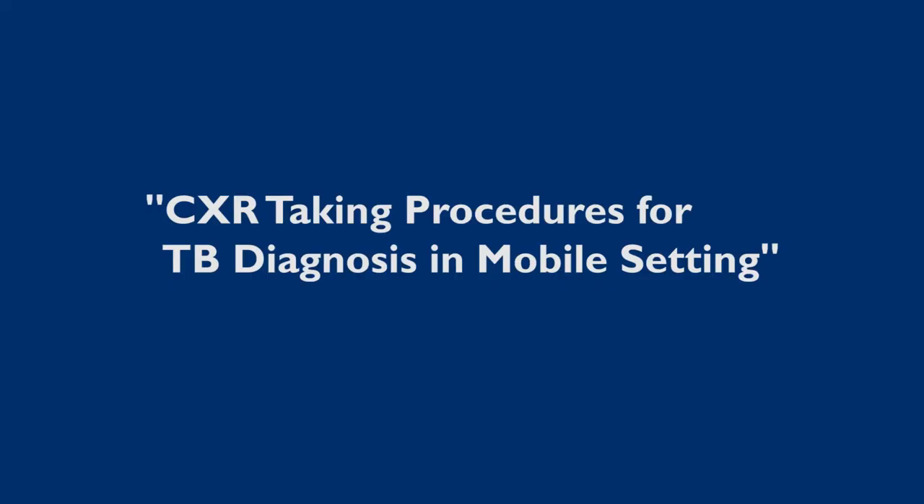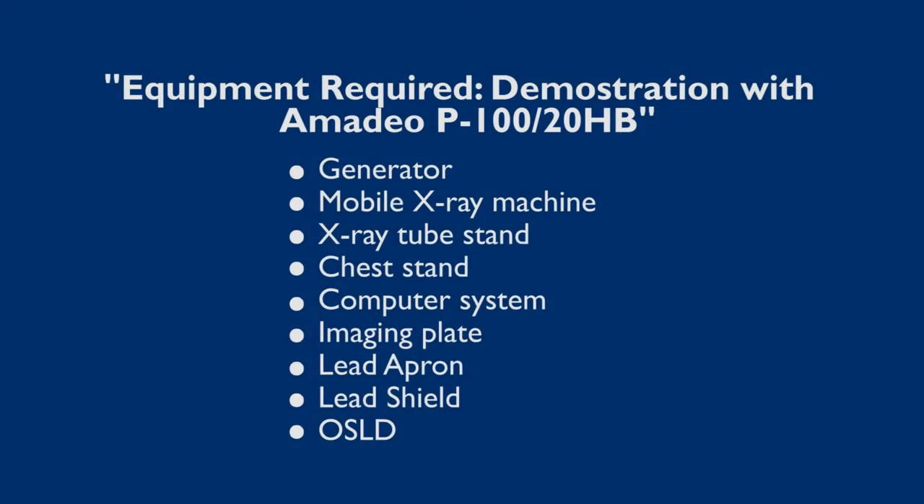In this teaching video, we will present the steps needed to take a chest x-ray in a mobile setting. This demonstration uses the portable Amadeo P100 20HB x-ray unit.